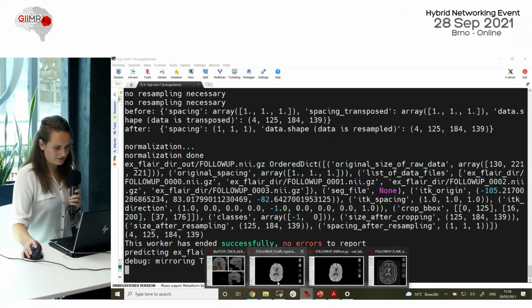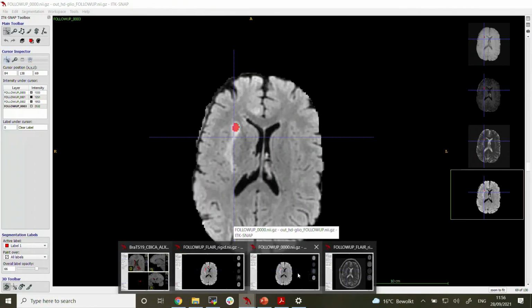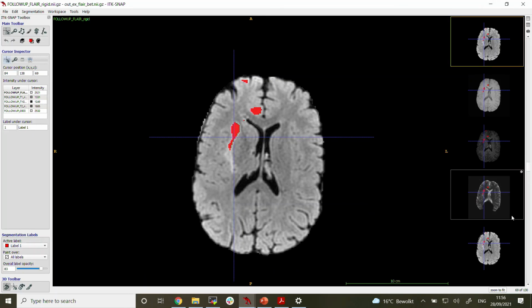And then I wanted to show some output. One thing I wanted to show you, again about the T2 FLAIR, is that it's very sensitive to pre-processing. In this case, I have 2 examples, and it's the exact same data.